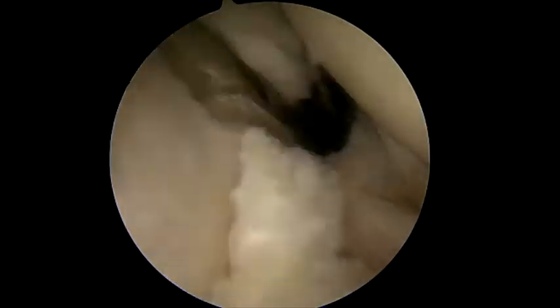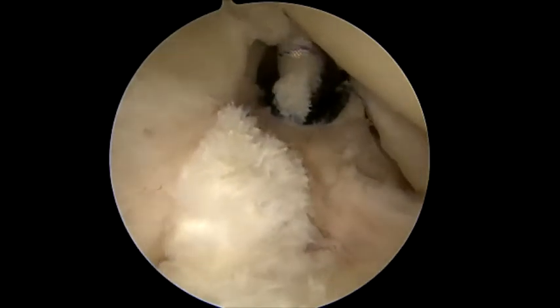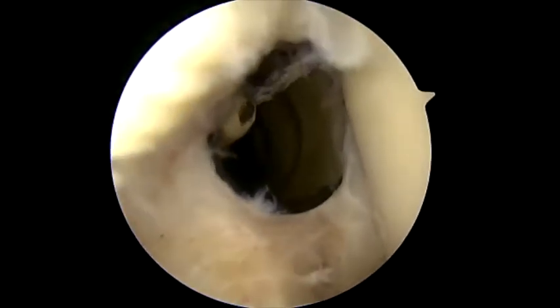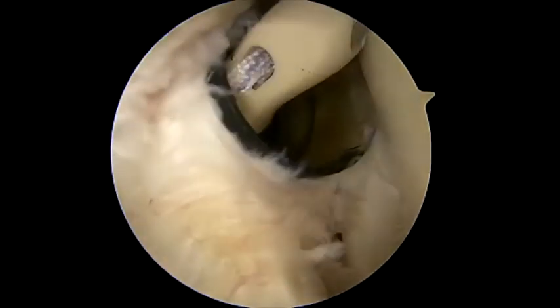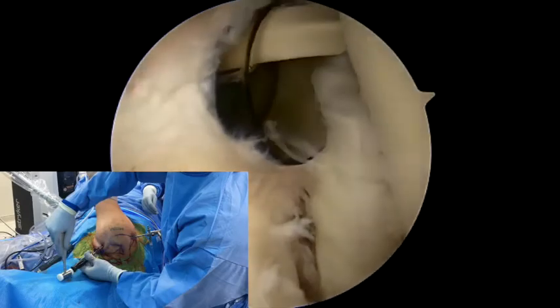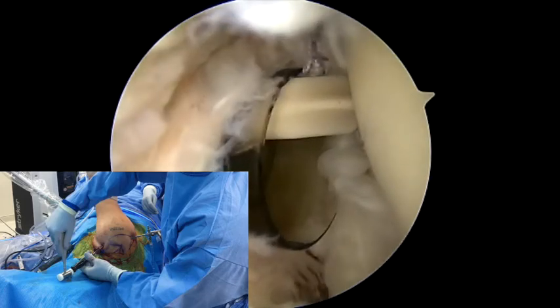The tendon is then cut above the sutures, and you can see here that we have very good fixation on the tendon. After debriding the stump of the biceps remaining on the labrum, the sutures are loaded into the self-punching eyelet, which is then directed towards the apex of the bicipital groove as far lateral as reasonably possible. This requires a more vertical and more medial approach than one might initially think, and I typically have the handle of the inserter somewhere around the patient's head.